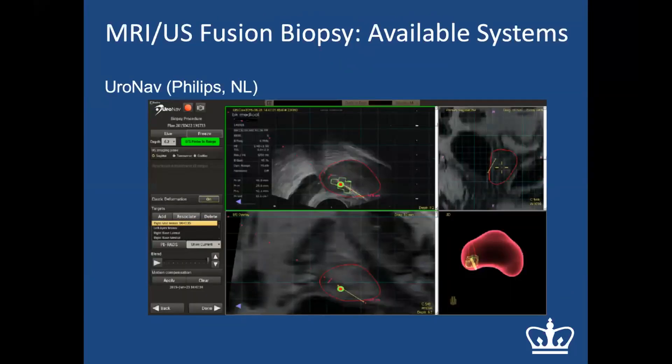In the clinic, the fused MRI-ultrasound 3D image of the prostate displays the lesion together with the prostate outline. In the sagittal view, a bullseye target appears, allowing relatively straightforward transrectal biopsy of the targeted lesion.